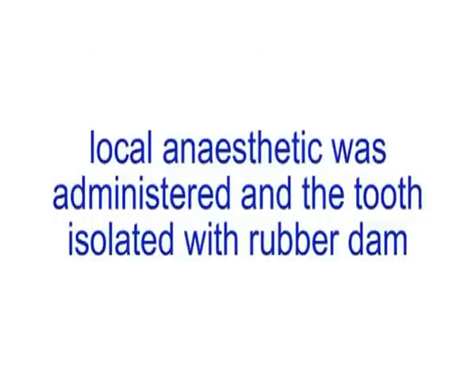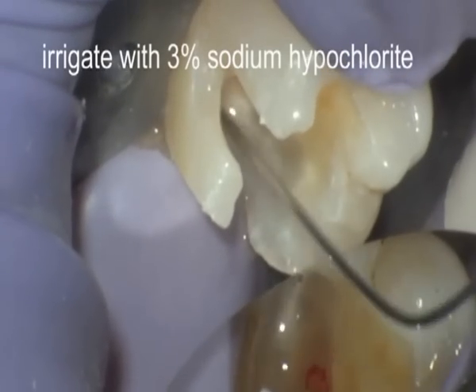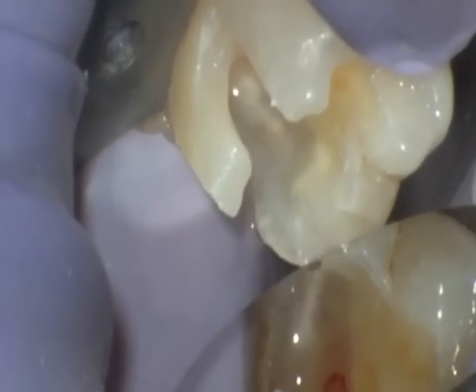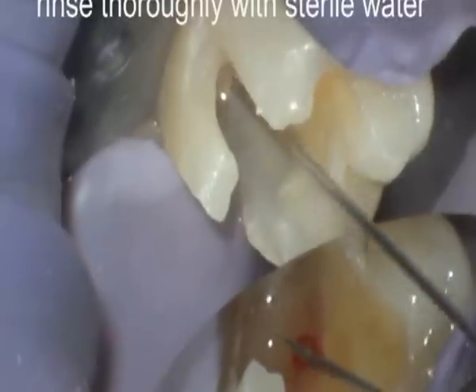A local anaesthetic was administered and the tooth isolated with rubber dam. The caries was excavated and the distal pulp horn was exposed, revealing normal pulp tissue. The cavity was irrigated with 3% sodium hypochlorite and then thoroughly rinsed with sterile water.